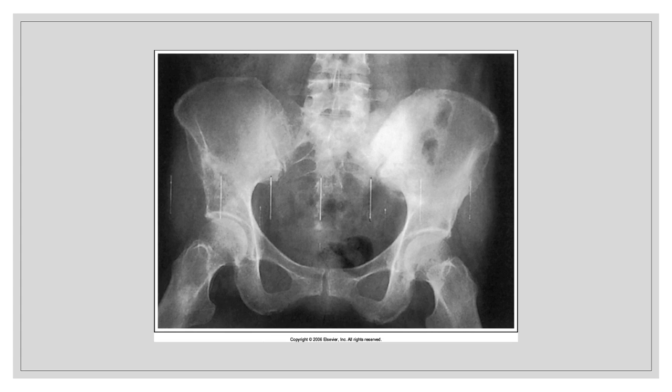What type of artifact? This is also something that you really won't see today. This is equipment. It's roller tank scratches that are going across the whole pelvis there.